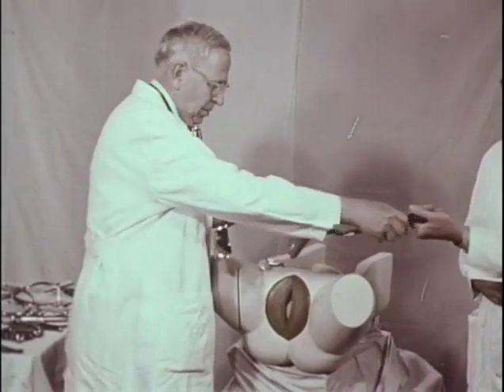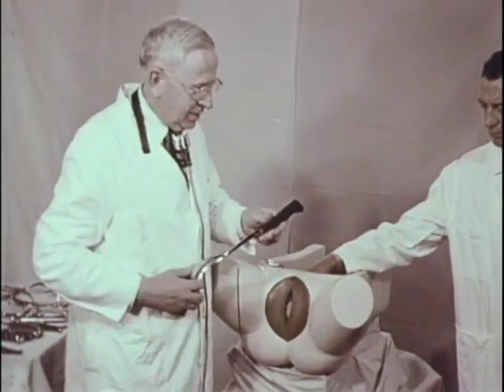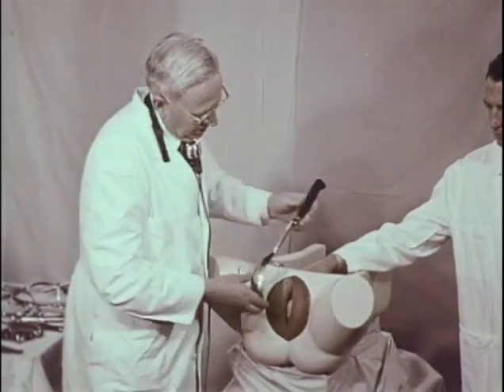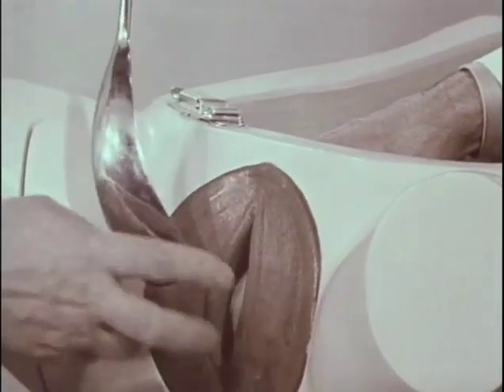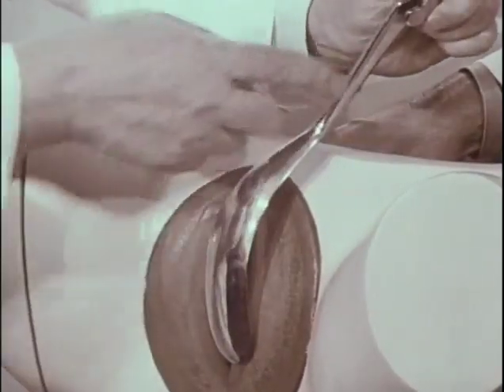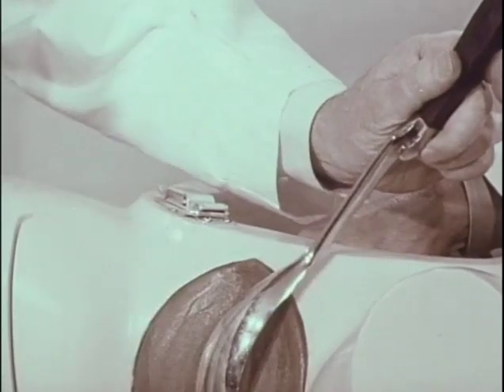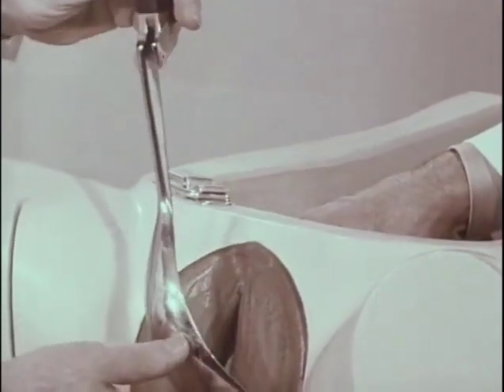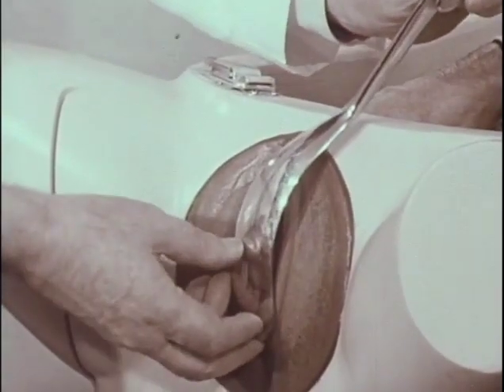Now, in the application, the posterior blade again is inserted first. That's the left blade, because this is a left-sided occiput. The handle is held in the left hand and is inserted directly posterior instead of to the left side because of the pelvic curve. And it will be noted that the plane of the shank and the handle is directed obliquely away from the perpendicular, as is the position for an LOA. But in the LOT, this is necessarily so, again, because of the pelvic curve.